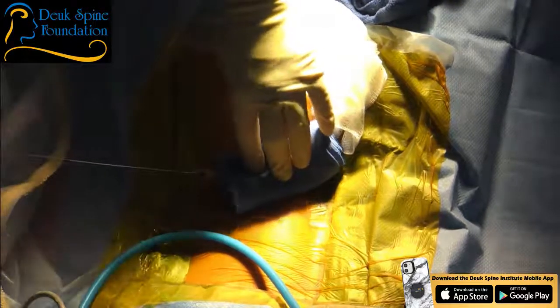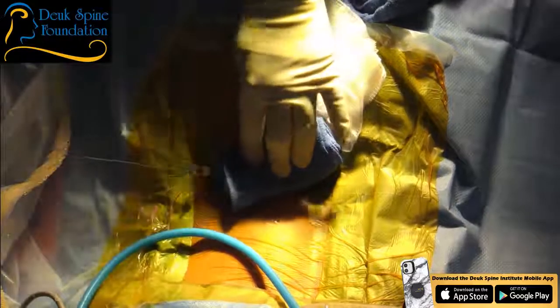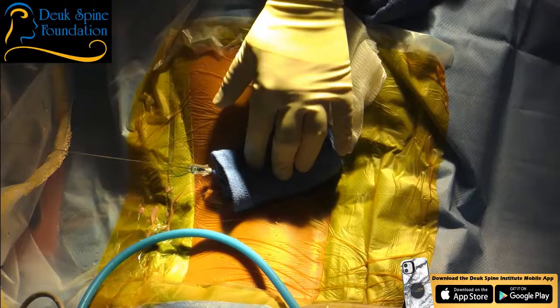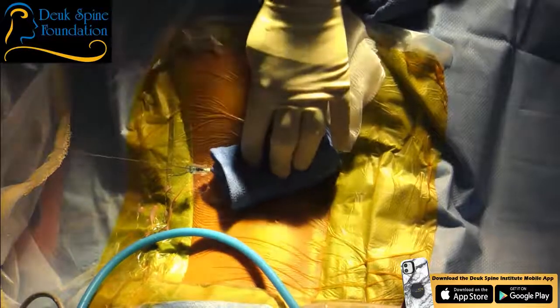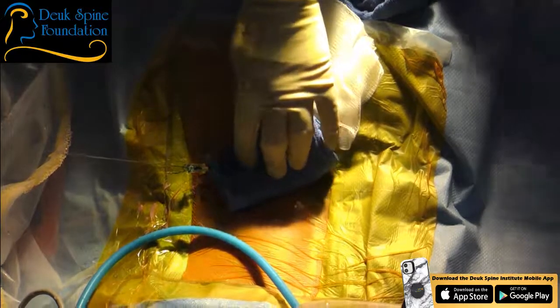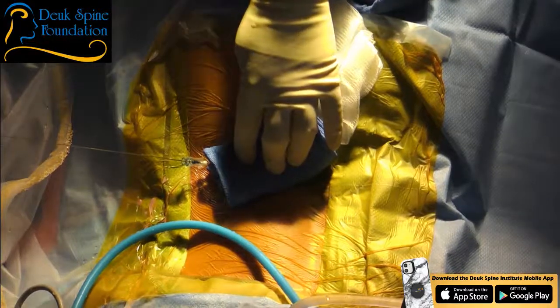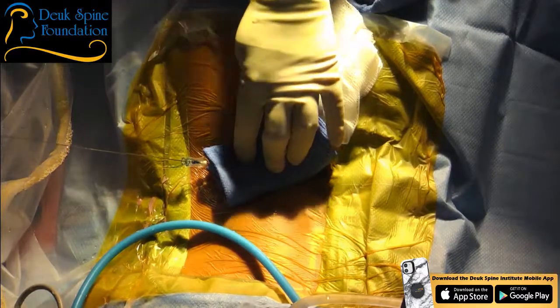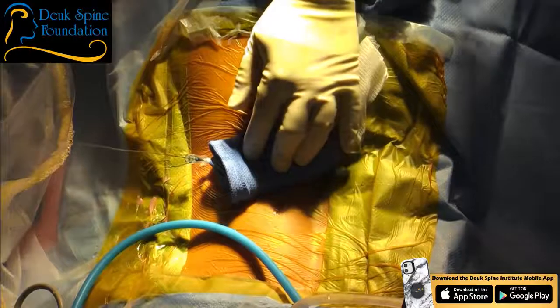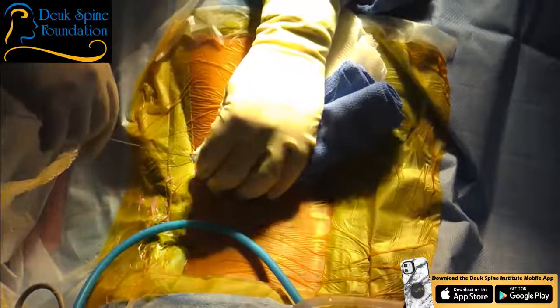Let's bring, by the way, you can actually see the screws and rods from her thoracic fusion, which I didn't do. I don't think I did it. I didn't do her thoracic fusion. Someone else did. You can't lower the floor, right? All right. A little more. Good. Shot. All right. So we're now going to do the L4-5 shot. Perfect. I'm going to take the needle out.